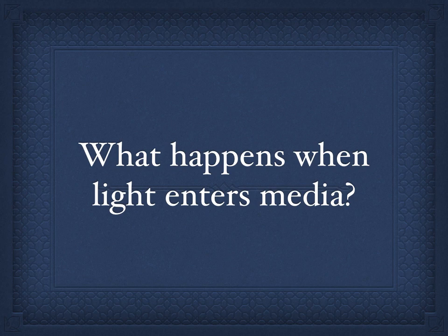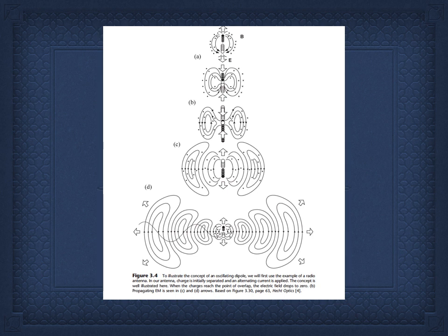So what happens when light enters a medium? And this is where it gets confusing to people because, okay, what happens when you send a light beam through water? Are the water molecules scattering? And how is it different if you have a water droplet in lipid? What happens is, this is from my textbook, but it was modified from the great Hecht textbook of optics, which is a great optics resource, and I highly recommend it.